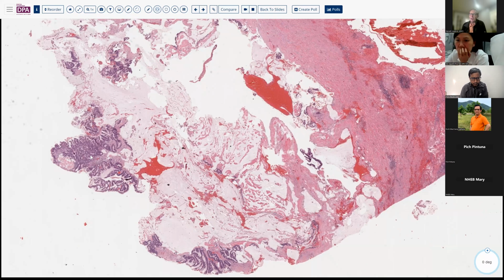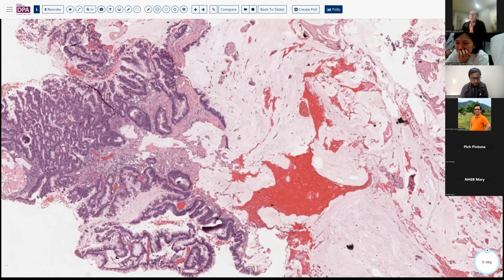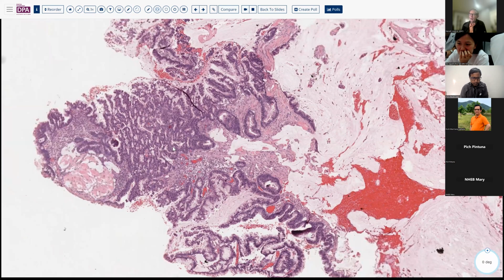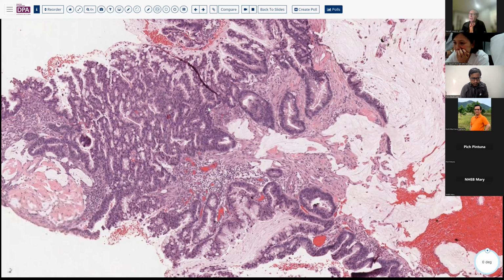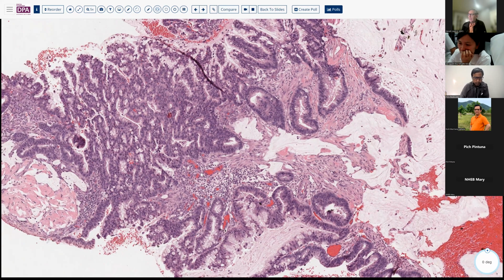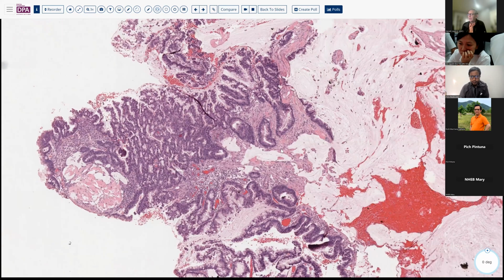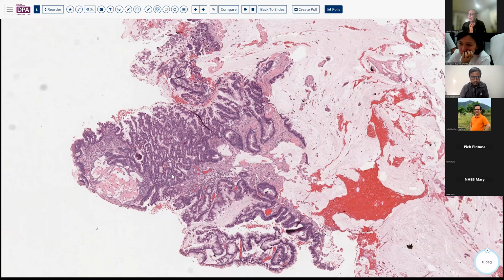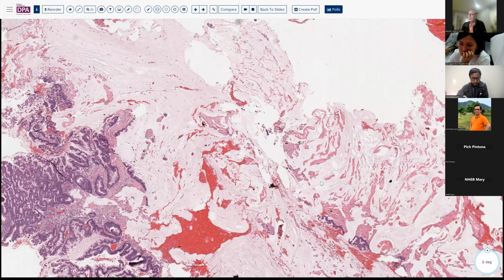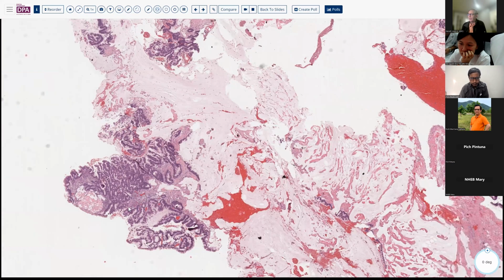Now here we see there's a higher grade dysplasia. You've got some residual mucin cells here, but you also have nearly cribriform solid type of tumor, as well as considerable dissection of the mucin into the soft tissues, forming this sort of pseudomyxoma type of pattern. These can be very challenging to identify margins and so forth.